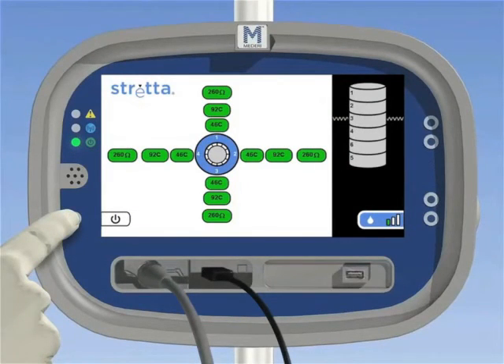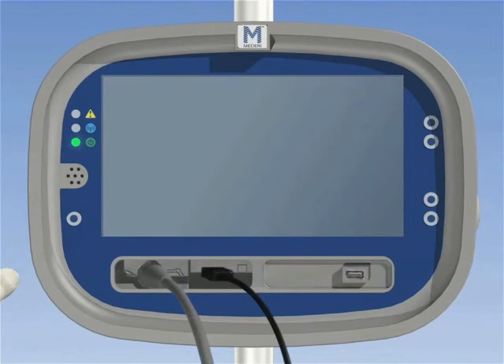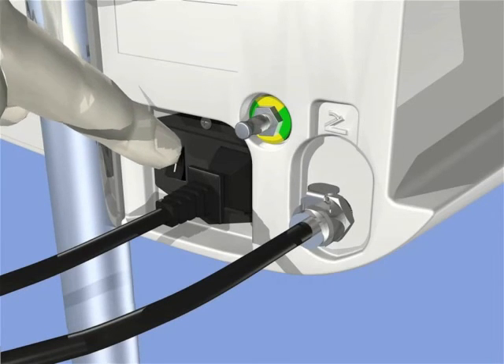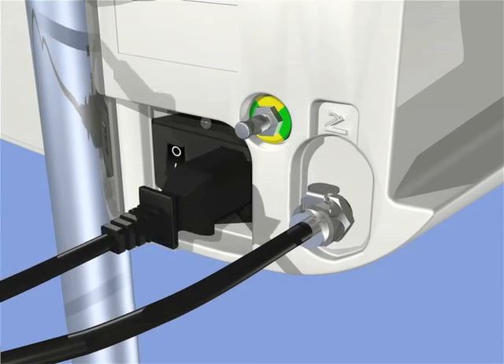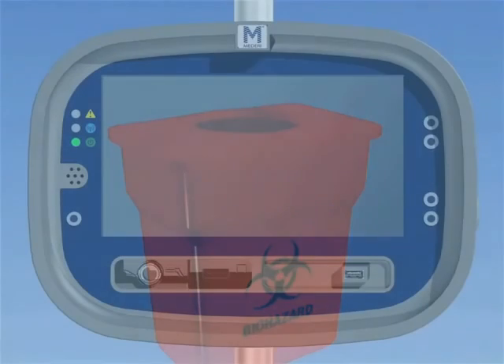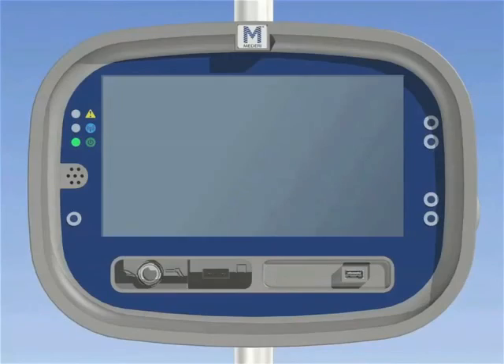71. Press and hold the power on mode button for at least 3 seconds until the display turns off. 72. After the display turns off and the green light flashes slowly, it is safe to shut off the main switch on the back of the unit. 73. Disconnect all equipment. 74. Dispose of the strata catheter and single-use accessories. 75. Clean the cables and generator per instructions in the operator's manual.